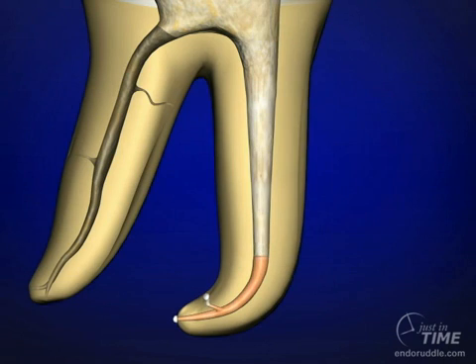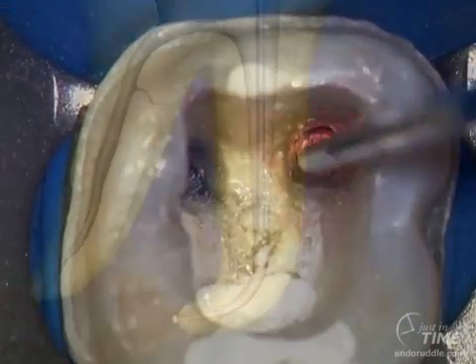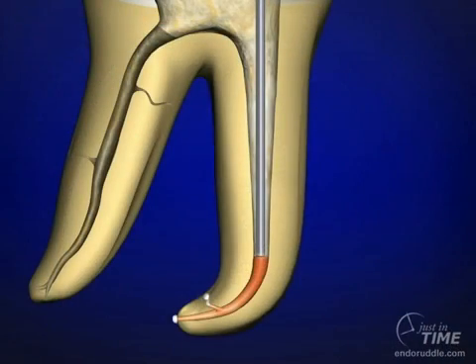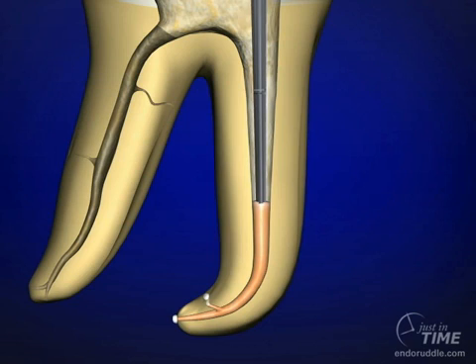At this stage, we would start to backpack, and I use the Calamus Flow device. The 23-gauge needle is very useful in posterior teeth and smaller diameter canals. Squirt in about 3 or 4mm. If you're going to get a void, it would typically be on the first squirt, so a smaller squirt is a little better. Discipline yourself to step the plugger circumferentially around the canal. Clean the lateral walls. The cycle concludes with a sustained 5-second press.